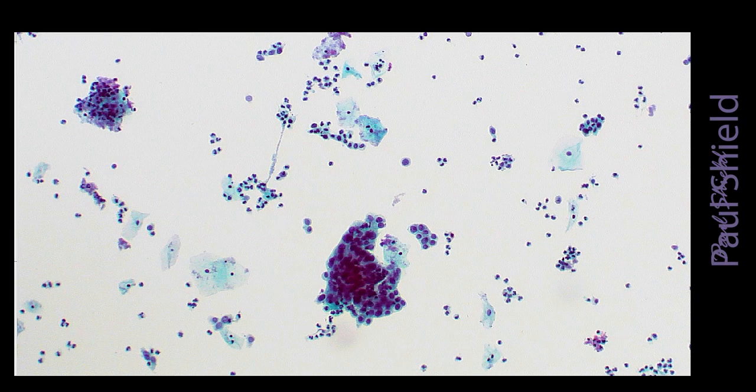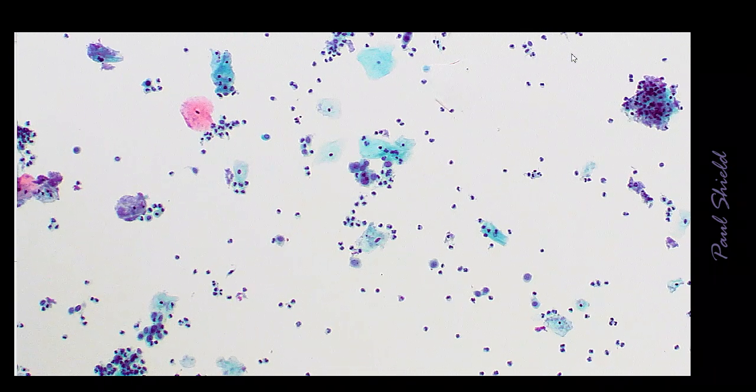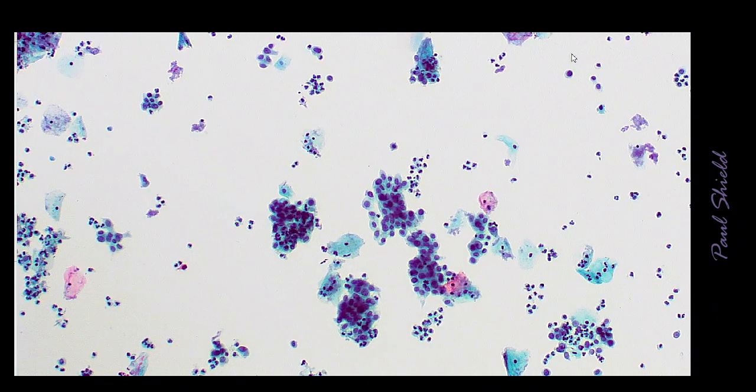First of all, the abnormal cells in the smears usually make up most of the cellular population, and often you have this picture, crowded hyperchromatic groups. You can see there's lots of dark small cells. They're arranged singly and in these loose groups and crowded hyperchromatic groups. So this would look like a pretty obvious high SIL on low power. There's a few normal cells around.